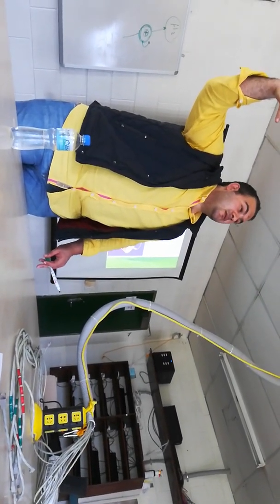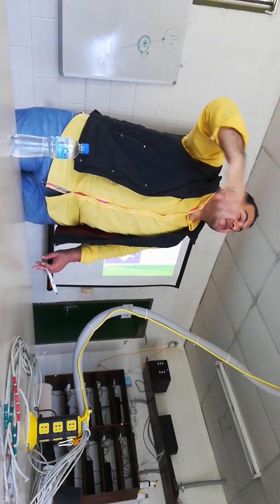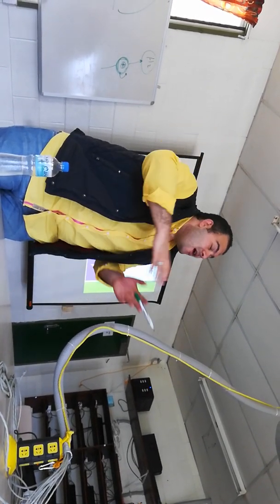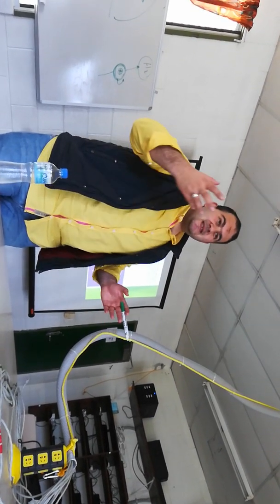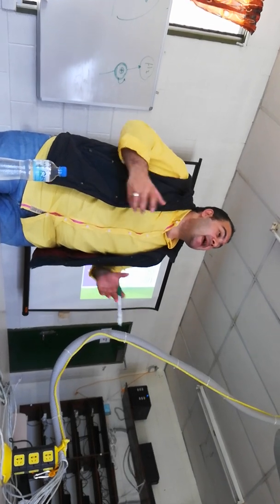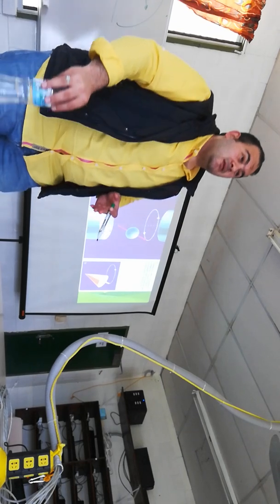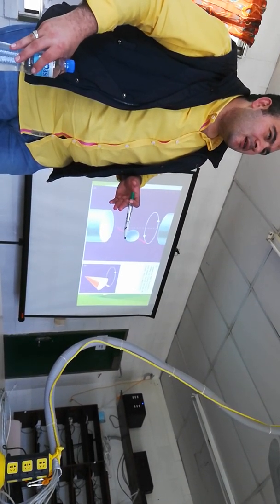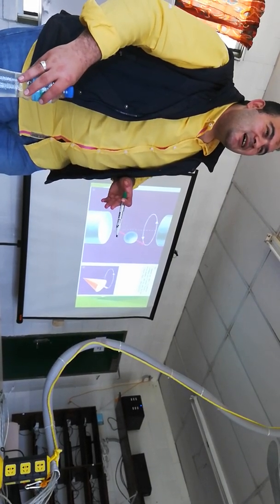External magnetic field. Now we have an MRI machine, 0.5 Tesla. If we increase the magnetic field, the effect of the magnetic field will be on a large number of protons. Okay, increasing the magnetic field, increasing the effect on a large number of protons. Okay, or do you have another question? No, I don't have a question. It's clear?